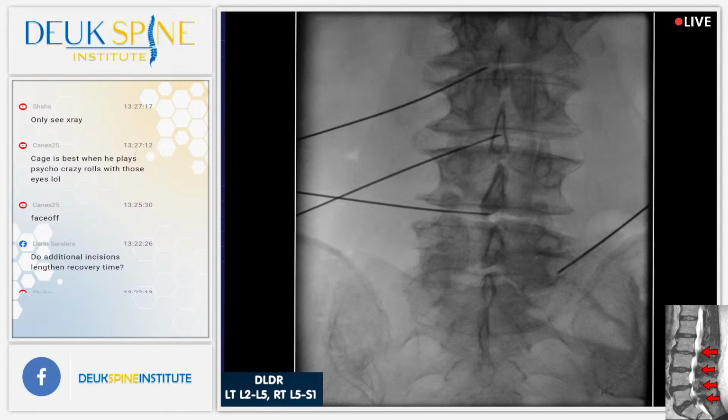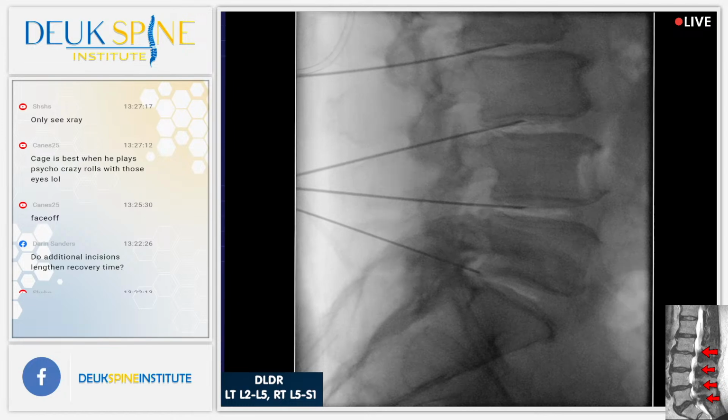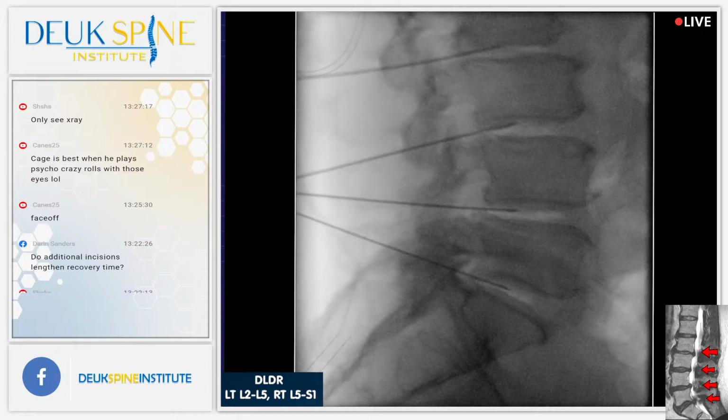You can see how he's more collapsed on the right side. There's a lot of bone over there. Definitely a Bertolotti's. He has a very abnormal transverse process, so I'm trying to find my way through. Let's hope it works. Feel anything? Anything? Sir, any pain down your leg? Where? In your back? Right side on his back, he said. Yeah, that's where we are. We did it. I don't know how we did it. Got lucky. Better to be lucky than good. Everywhere on the right side, he said. All right, relax. We're good. We got everything in where we needed it to.